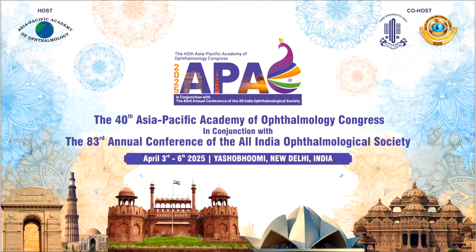If you have a sclerotomy which is horizontal, and this T is also horizontal, it may not sit properly. If you have the sclerotomy vertical like this, then you have a T which is like this, so that will cling on to the sclerotomy very nicely. Very good example, sir. Yeah, shirt button. Always think of that.